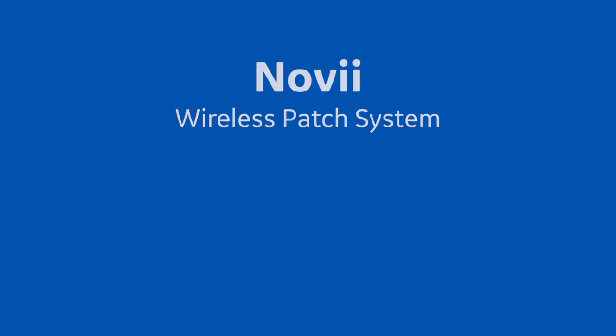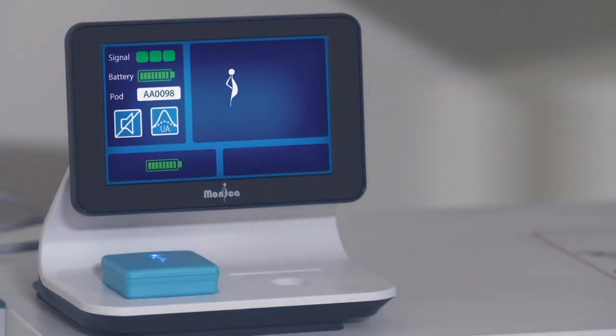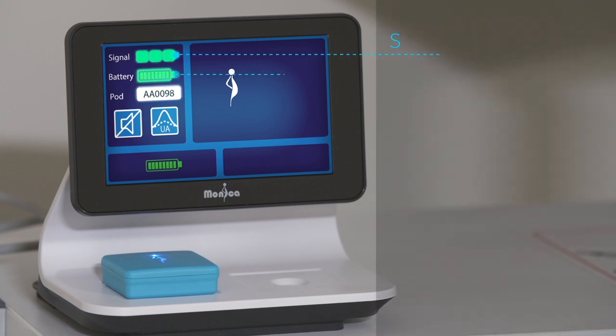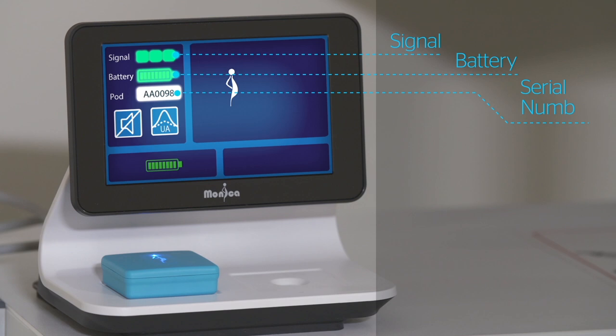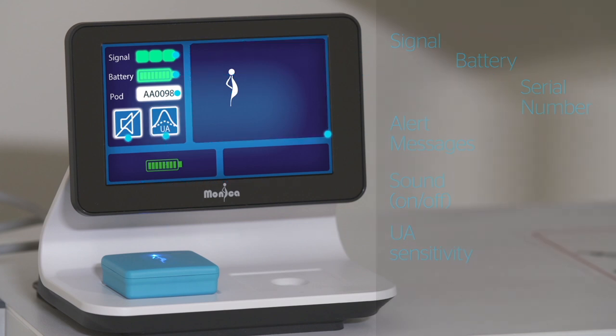Training Session 6: The Monitoring Screen. The Novi interface monitoring screen is divided into three sections: pod information including fetal ECG signal quality, battery life, and serial number of the monitoring pod; help support information and alert messages; and user controls including sound on/off, and UA sensitivity high/low. These two controls are only shown during monitoring, and touching the icons will toggle between the two states.